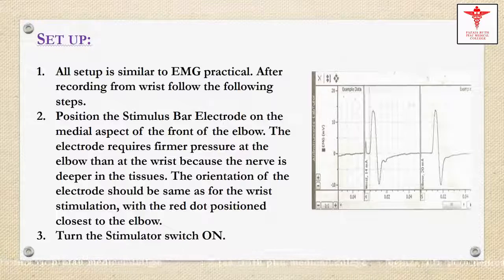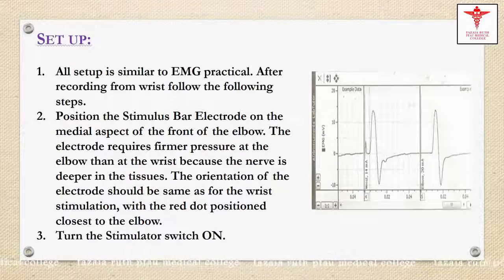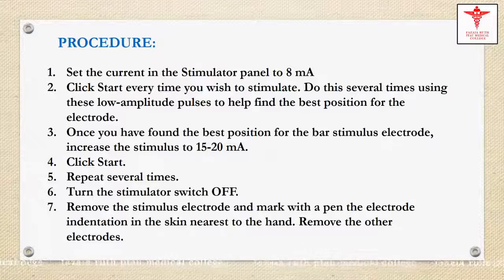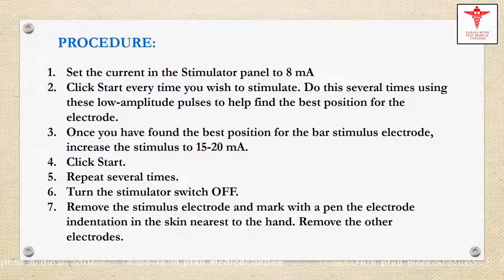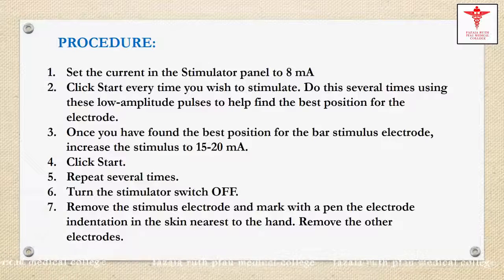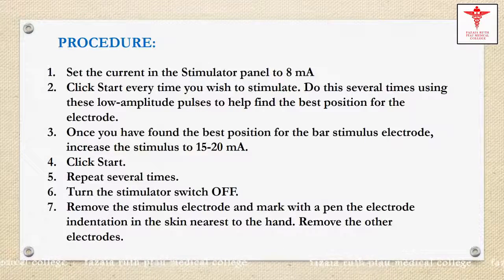Turn the stimulator switch on. Set the current in the stimulator panel to 8 mA. Click start every time you wish to stimulate. Do this several times using these low amplitude pulses to help find the best position for the bar. Once you have found the best position for the bar stimulus electrode, increase the stimulus to 15 to 20 mA.